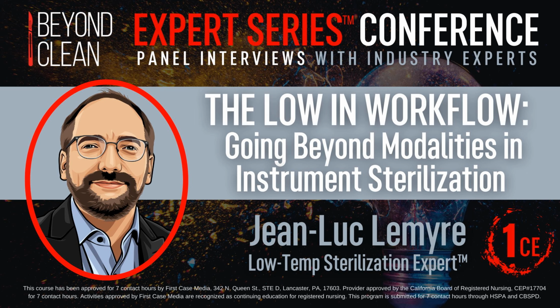When we think about patient safety, it's different requirements. So the first one is very obvious. It's sterilization efficacy. We make sure that whatever goes in there within the claims should be sterile to prevent infection. That's the main purpose of the sterilizer. Biocompatibility is very important. So again, the residual peroxide, the design should allow for the sterilizer to remove almost all of the sterilant on the device. There's some trace of it, and it's fine as long as it's within the right limit.